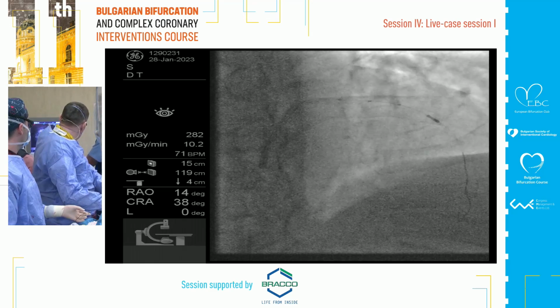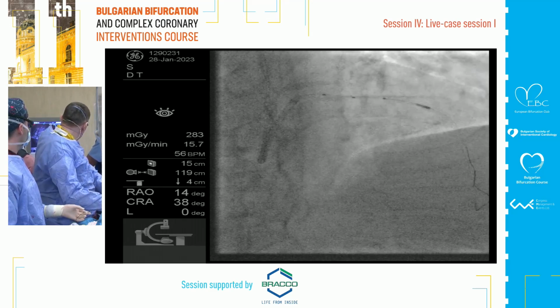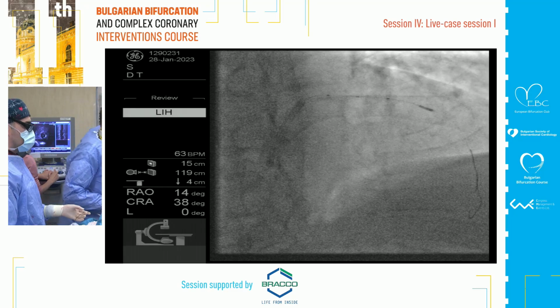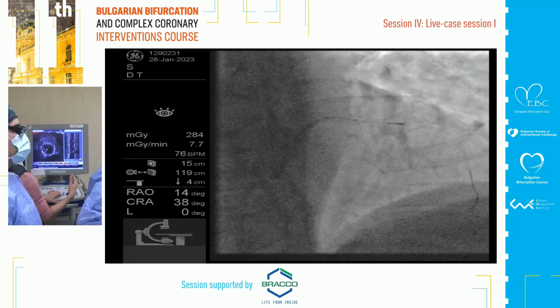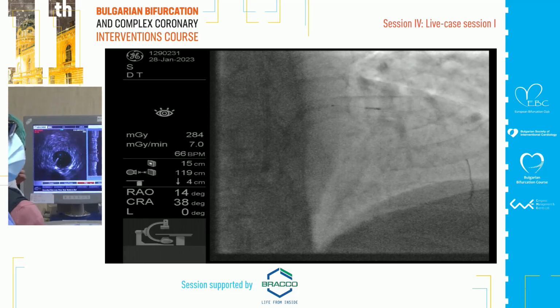This is a diag, and still we are normal. We cannot see. Dobrin, can we move? And we don't see. This is a soft plaque. Sorry, we don't see the IVUS. Okay, and we will show later, don't worry. And this is still normal. We are talking about the distal region. We didn't see the main region yet. Come back.